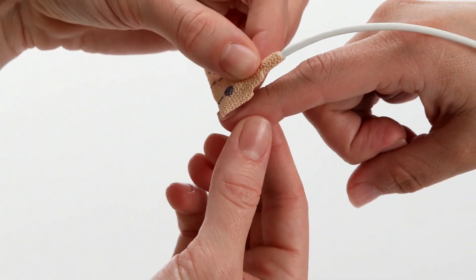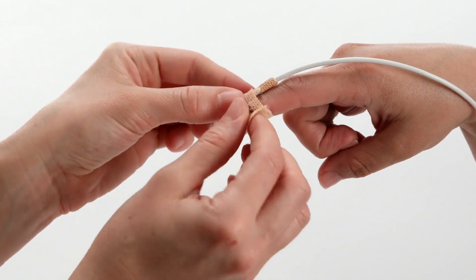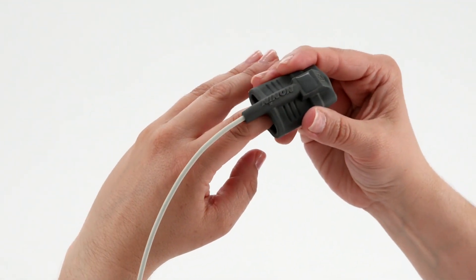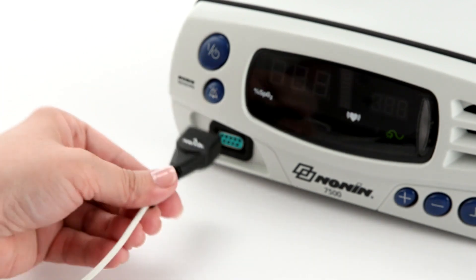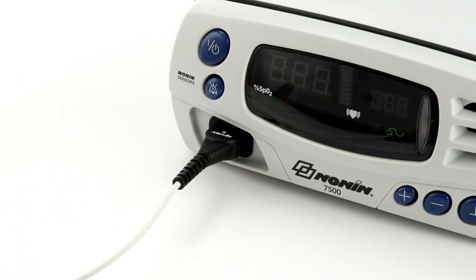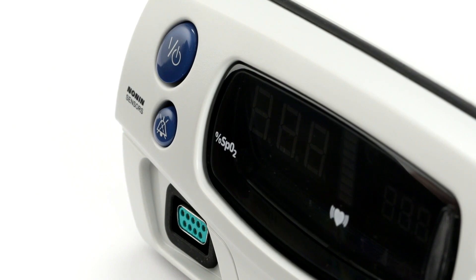Prepare the sensor and place it on the patient prior to connecting it to the oximeter. Proper sensor placement is critical for accurate readings. Follow the instructions for each sensor type to ensure secure, aligned positioning of the sensor on the finger or skin surface. Connect the sensor to the pulse oximeter by inserting the plug with the Nonin logo facing up into the sensor port on the front of the oximeter as shown here. The connector should fit firmly in the connector port on the oximeter.